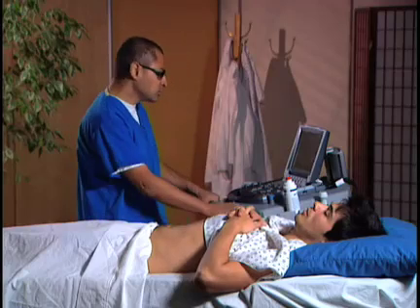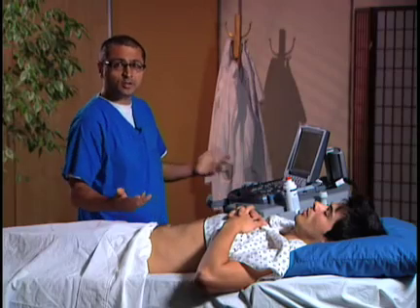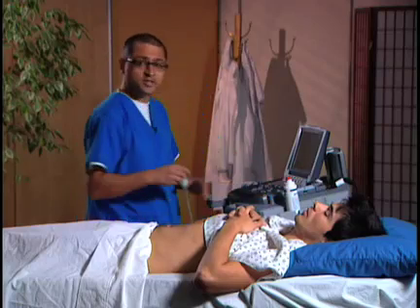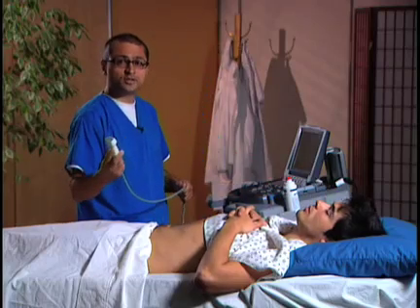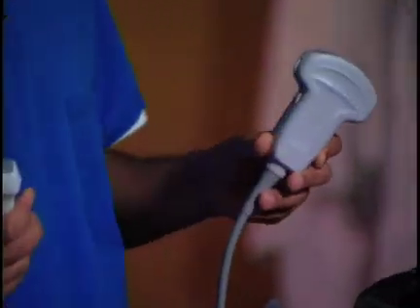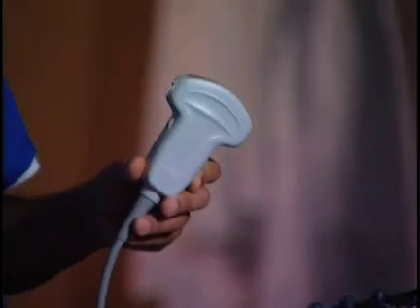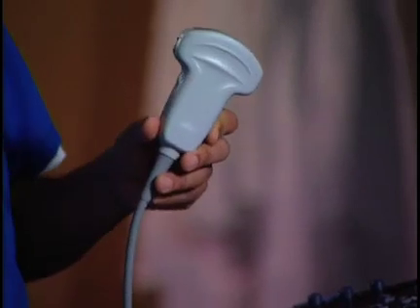We have an M-Turbo system here, already powered up and on. We have a selection of two different transducers. This is a phased array transducer — the same transducer you're going to use for the FAST exam and for echocardiography. The other transducer you may also have is a curvilinear transducer. This is an excellent transducer, though you'll sometimes have problems with rib shadows. For today's demonstration, I'm going to take you through a phased array.